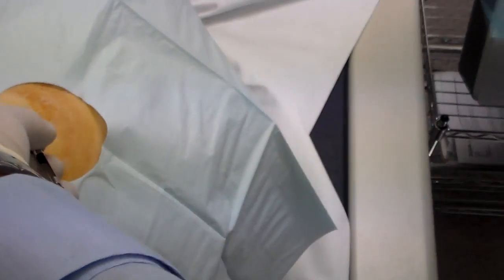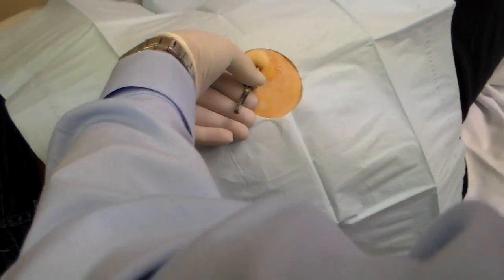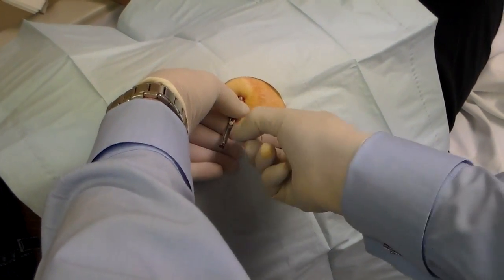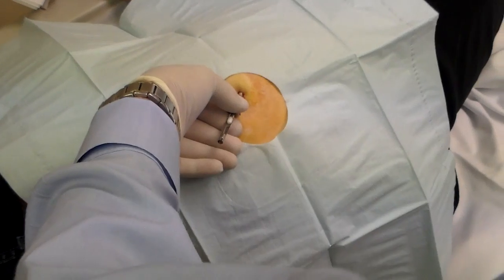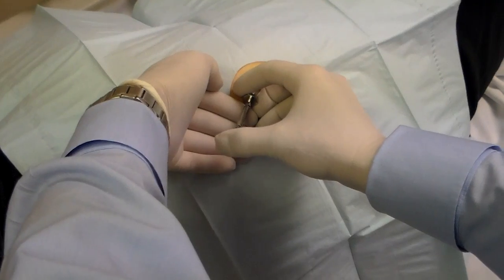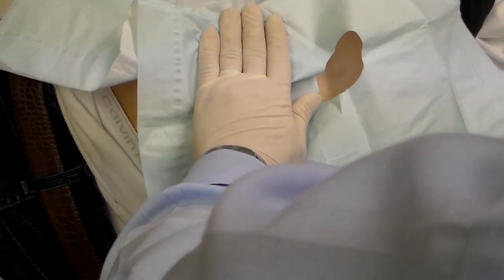You then remove the stylet, take the pellets, and insert them — one, two, and three — into the slot. Take your plunger at the flat end, push slightly and they slide right in, then pull your trocar out and the procedure is done.